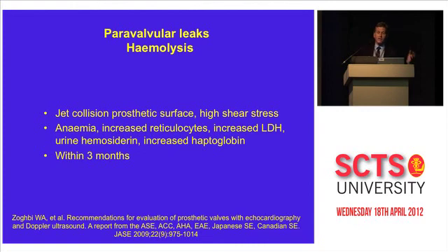Hemolysis, and when does a jet cause hemolysis? They say the higher the velocity, the more the chance that it will cause hemolysis. So if you've got a big paravalvular leak, it probably won't cause hemolysis. But with that, usually after 3 months or so, you find that the patient's HB drops.